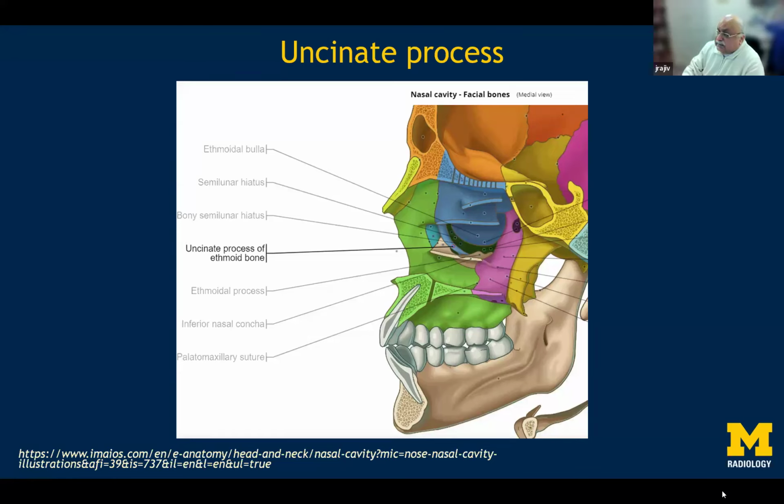When we are doing this, we are actually looking at and trying to preserve the middle turbinate. Sometimes the middle turbinate may have to be removed as well. So we need to go back and then widen this in entirety. And this is the area of the skull base. And these are the perforated appearing cribriform plates on either side of the midline. So this entire piece of bone is very important, save the superior turbinate here.